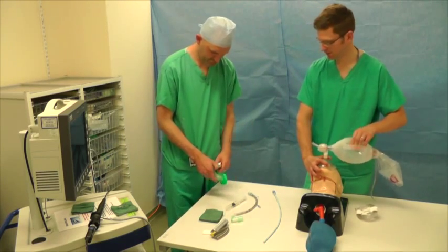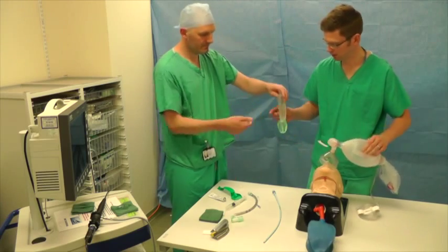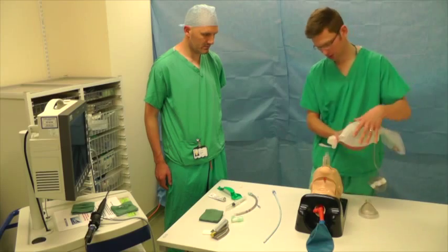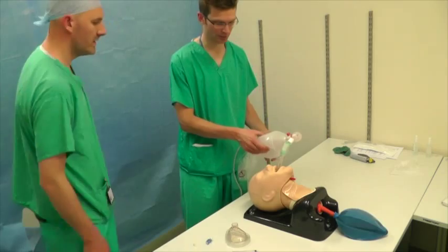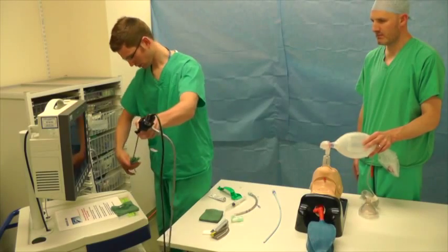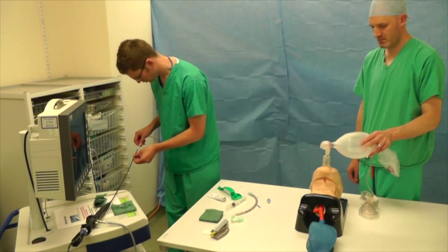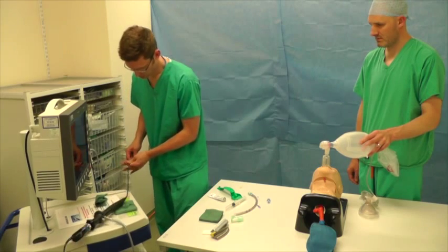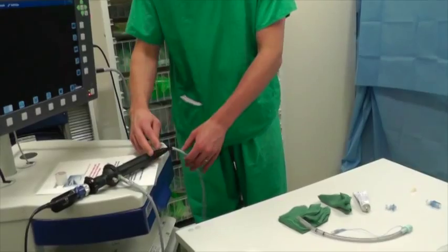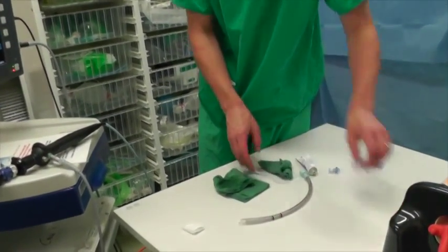Have you got an iGel in place? I'll just get it ready. Okay, ventilating nicely. Can you just take over bagging for me while I get everything else together?